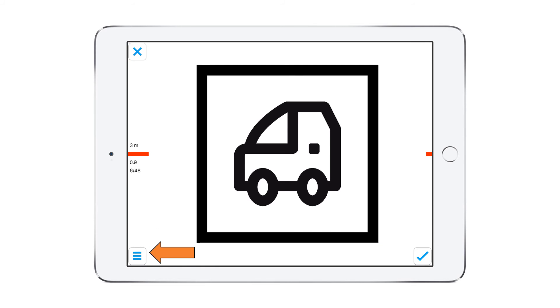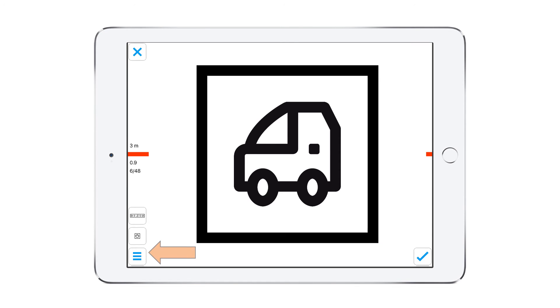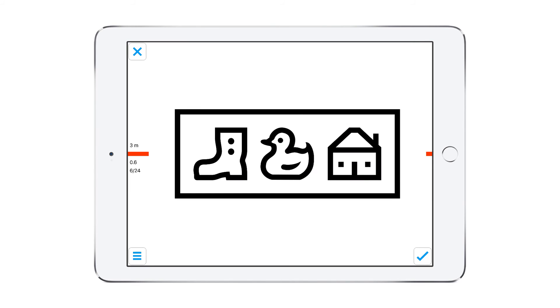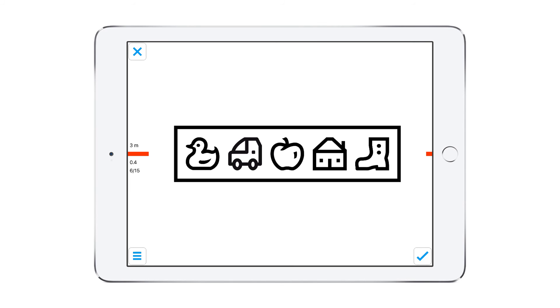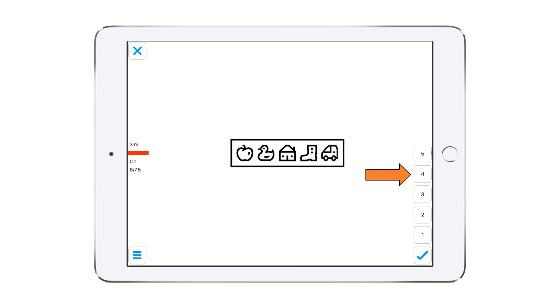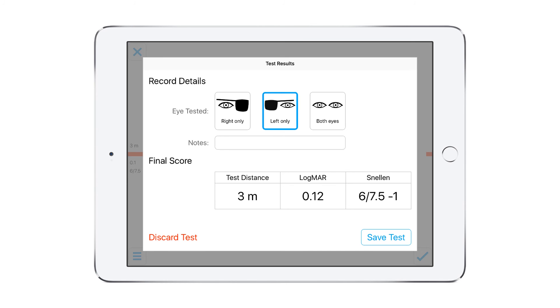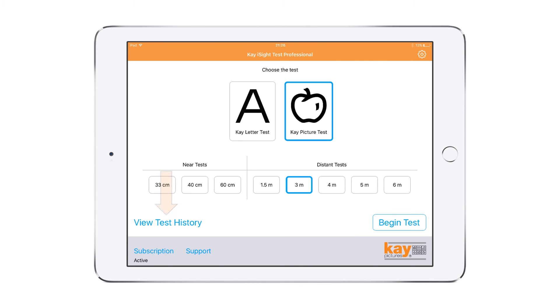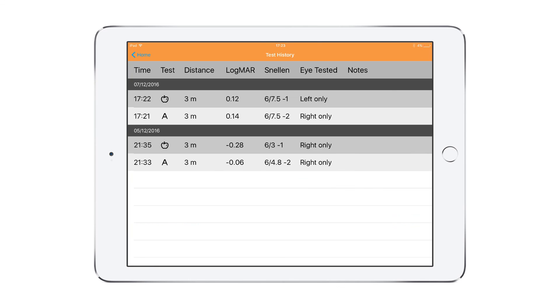Picture testing works in the same way. Choose Single or Crowded. Scroll up or down to change the sizes, and save or discard the information. Any saved results are kept in the test history.